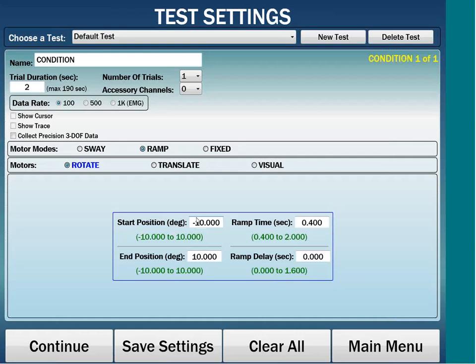So first, I use my clinical SOT protocol to establish a baseline for Christina, whose performance is compared to normative data. I will also retest Christina using the clinical SOT when she returns from space. This is part of the beauty of the Balance Manager system option with data software, because it provides me the capability and freedom to use both clinical and research protocols for my research.